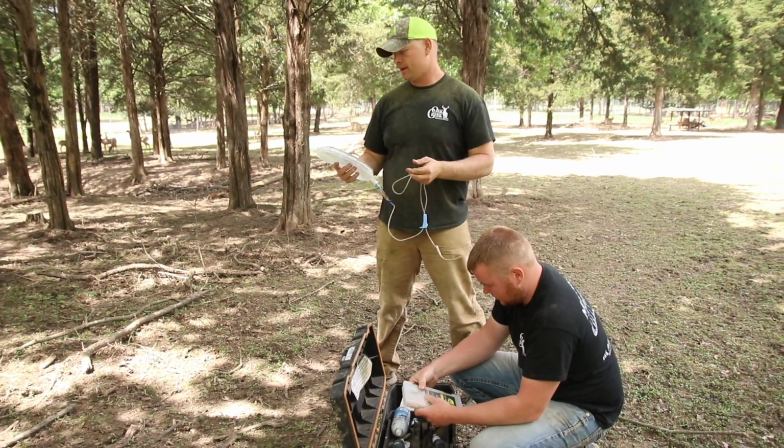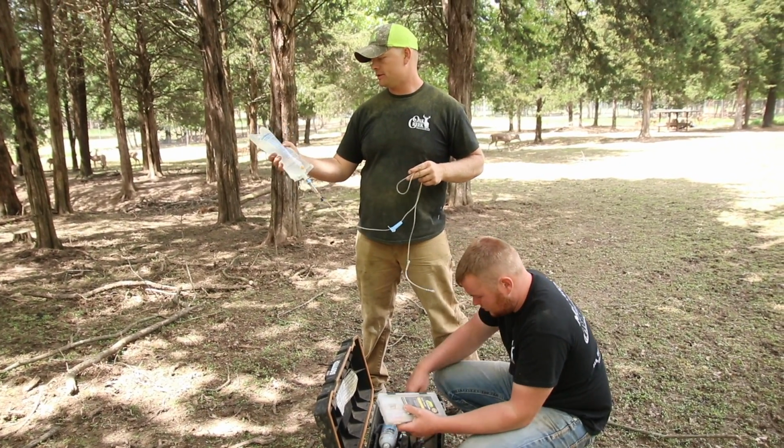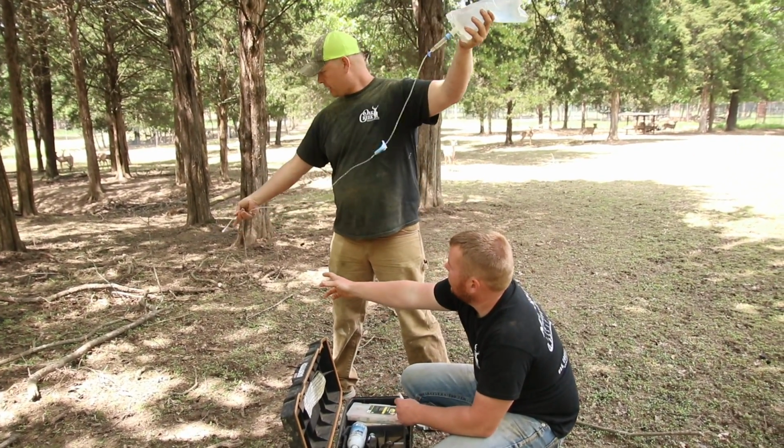I call them an IV bag. There's normal saline, or I don't know how you'd say it, but basically most people would consider it an IV bag with a drip set. And I'm flushing it right now.